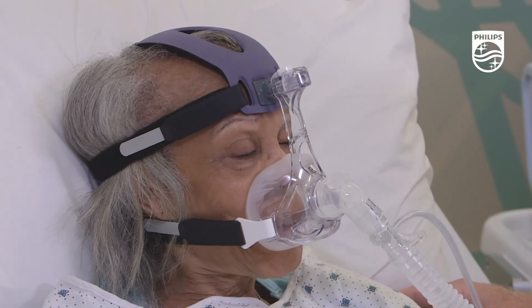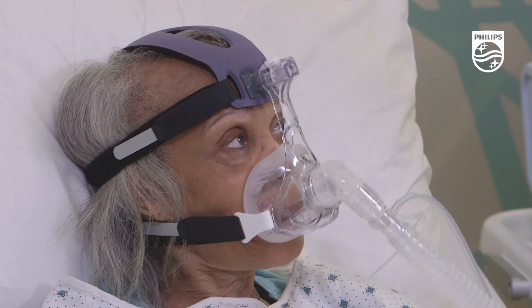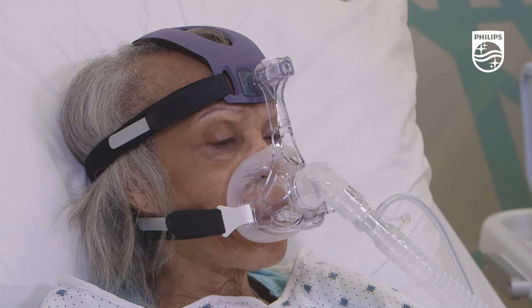Consider asking your patient if the mask feels comfortable on their face. The bottom of the cushion should rest just above the chin, with the mouth slightly open.